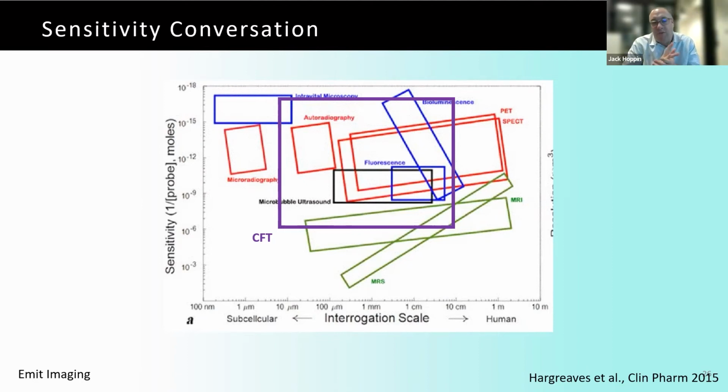It's very hard from the dynamic range of a nuclear system, not just because of the 12-bit, really just because of the way we're collecting the impinging photons in the detectors themselves and reconstructing them. You're going to have artifacts associated with hot and cold, and that limits the dynamic range of a PET, microPET, or microSPECT, or clinical PET. It's a general tomographic issue.